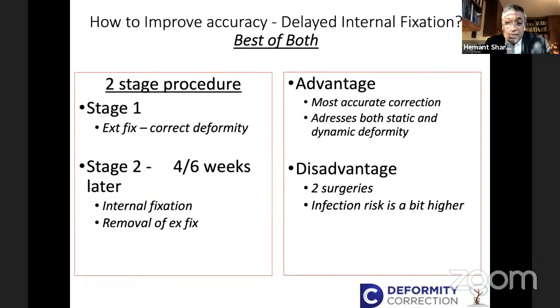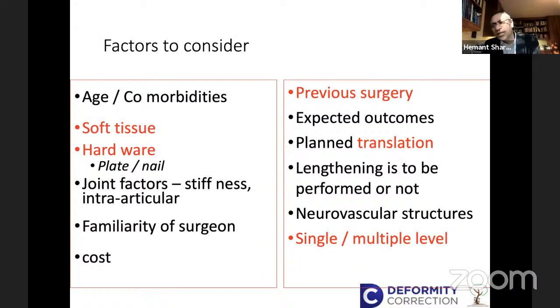And as I said, the principal disadvantage is it is 2 surgeries, and the infection rate is probably a bit higher, because if your internal and external fixation device touch each other, then that can be a bit tricky at times. But the incidence is quite small.